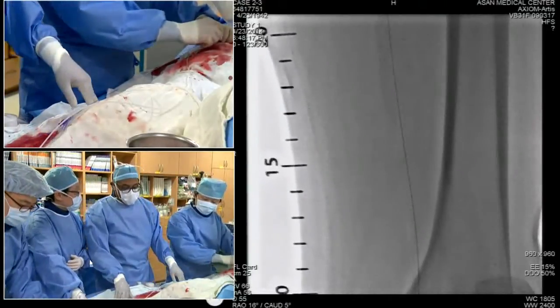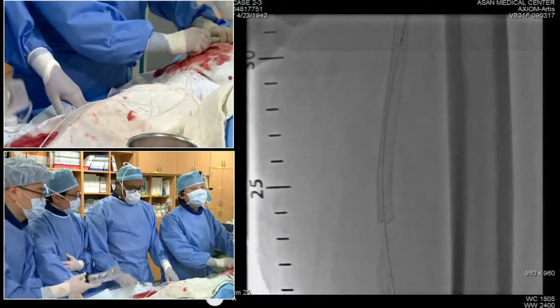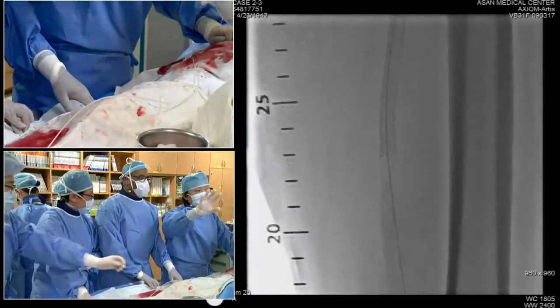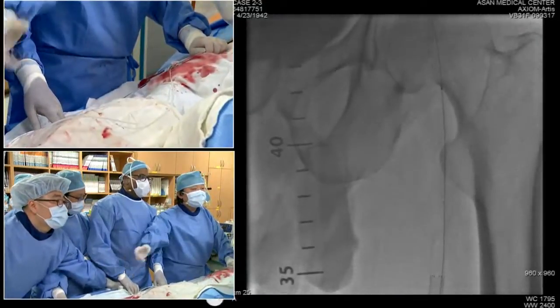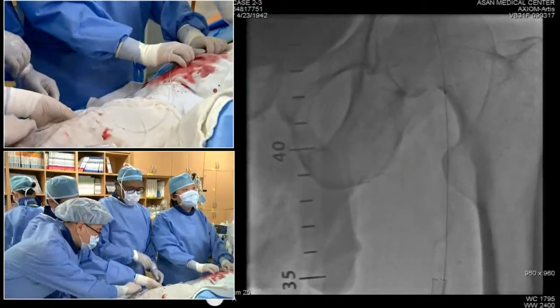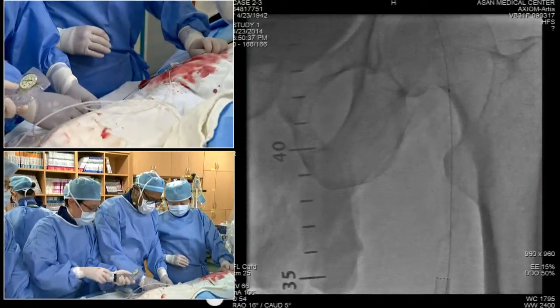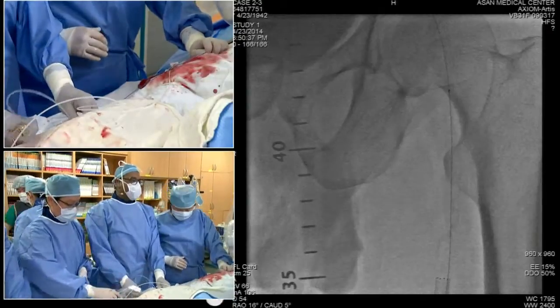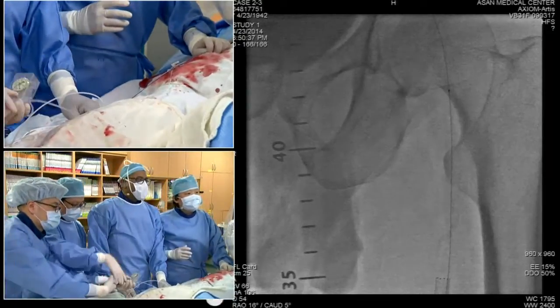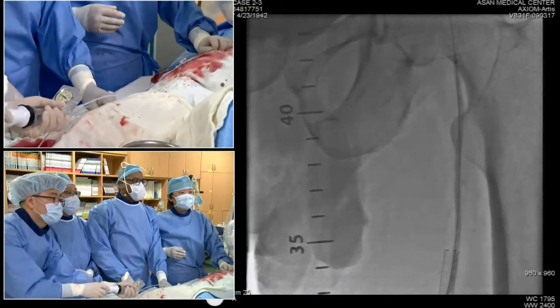Is that the plan? Well, if you change the calculus here for me, if you have a drug-eluting balloon, you're all the way up. Okay. So that now becomes a different story. If we have the option of a drug-coated balloon, that's great. I think we would need to pre-dilate the entire SFA first. So presumably the team will use a pre-dilatation.